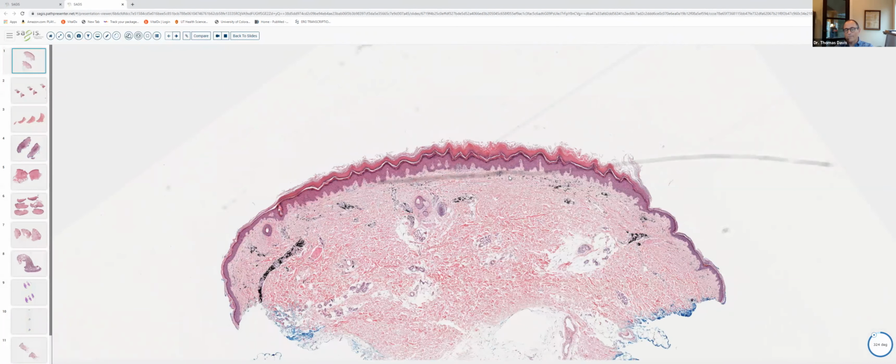And these macrophages contain within their cytoplasm these granules, but the granules are not uniform in size. Some are big and chunky, and some are quite small. And if you had a fine focus on your microscope, you could see that these were actually refractile. And then out at the periphery, there are actually a few multinucleated histiocytes and fibroblasts as well.